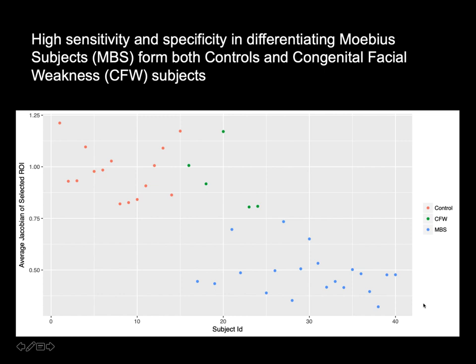Yeah, I guess I don't mean variability. I mean the extent of the distortion for the patient seems less than. No, this is after the correction of the distortion in the EPI. This is the morphometry. So both patients and controls had the correction of the echoplanar images. That is the first step, having morphologically faithful diffusion data. This is a step that you don't need with T1 weighted images, because T1 weighted images are not distorted, okay? So that is the first step. So that was applied to patients and controls.